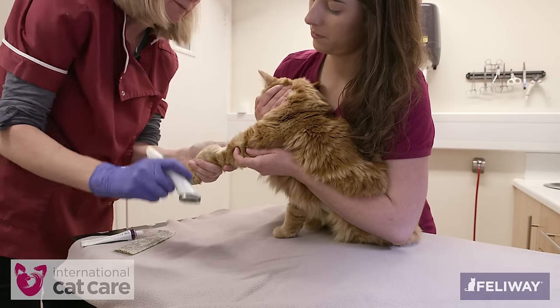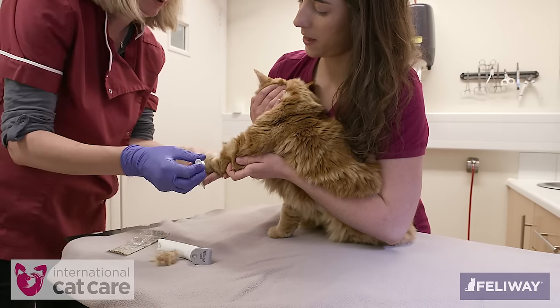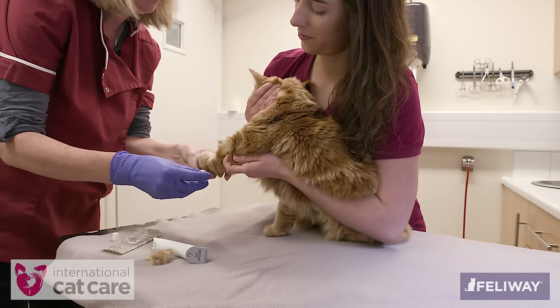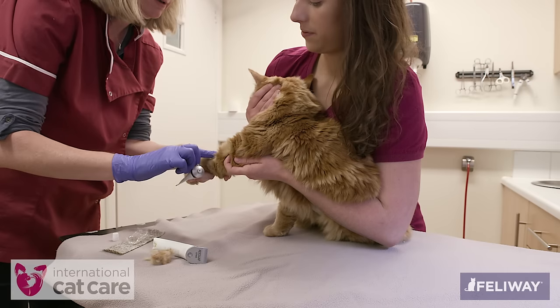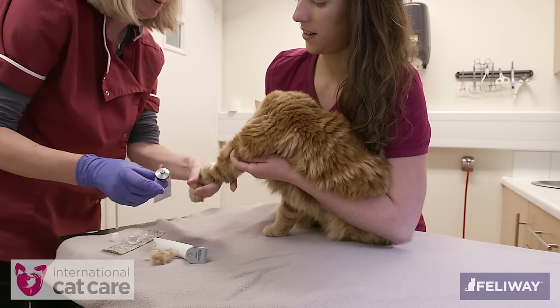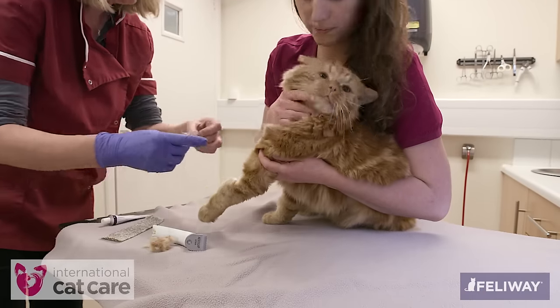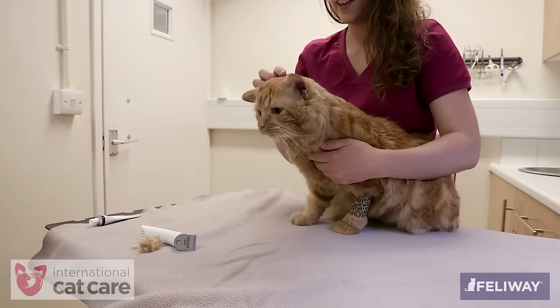This cat is less comfortable and requires more security to stay still. This time, the assistant holds the cat to her body and tucks the cat under her arm. Her right arm holds the cat's head against her body. The assistant also talks quietly to the cat, rubs its chin, allows it to change position, and strokes the cat once the dressing is placed.